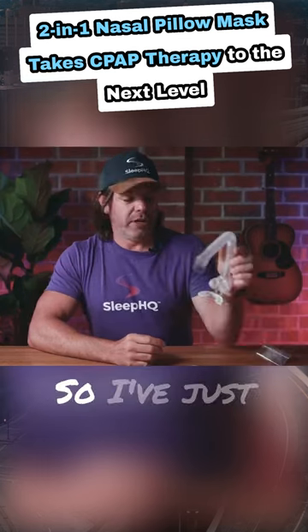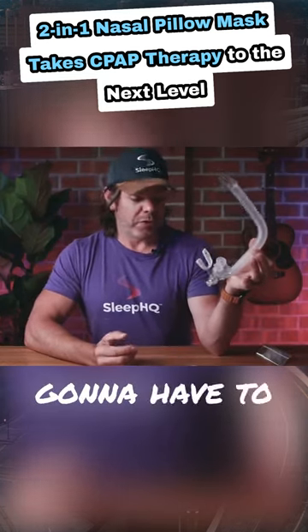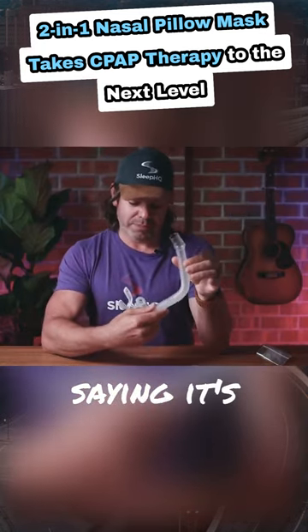All right guys, so I've just stumbled across this — my Tap-Pap. It looks like I'm gonna have to do a proper review on this mask, because from what people are saying, it's bloody unreal.